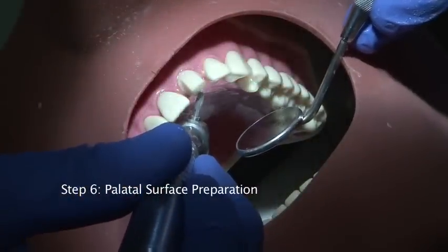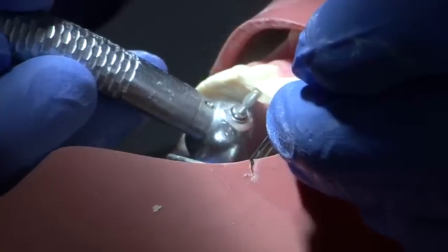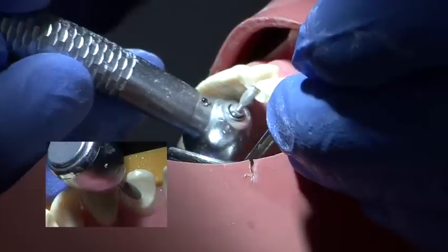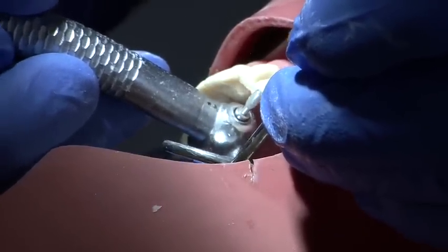The remainder of the palatal surface is then prepared using a medium grit rugby ball shaped burr. It is important that the cingulum is not over prepared at this stage, and a putty matrix must be used to ensure evenness of preparation.